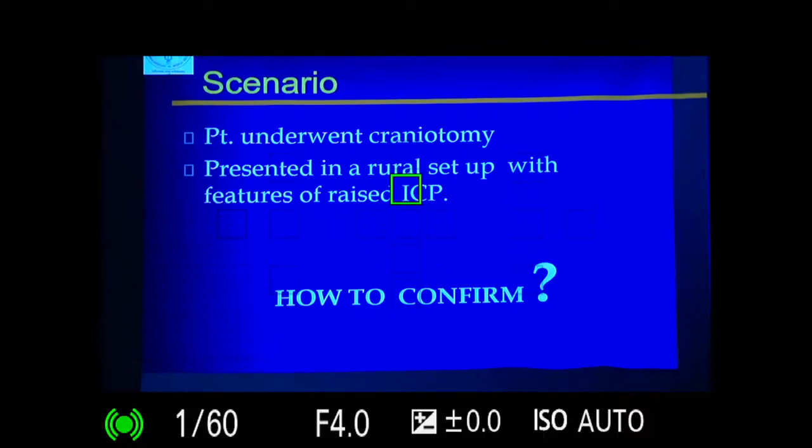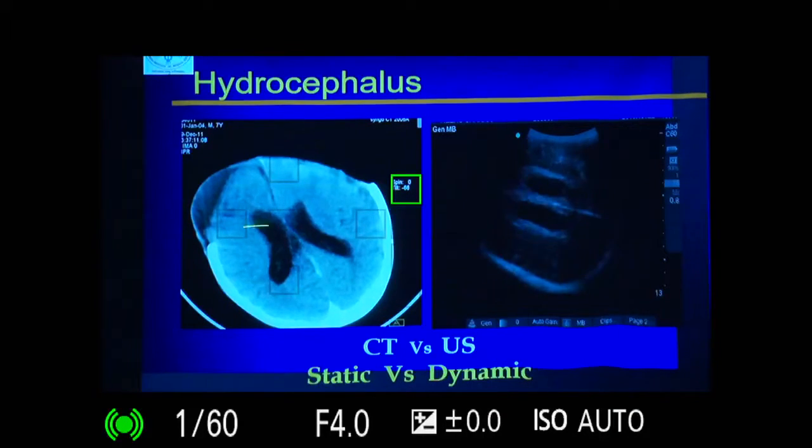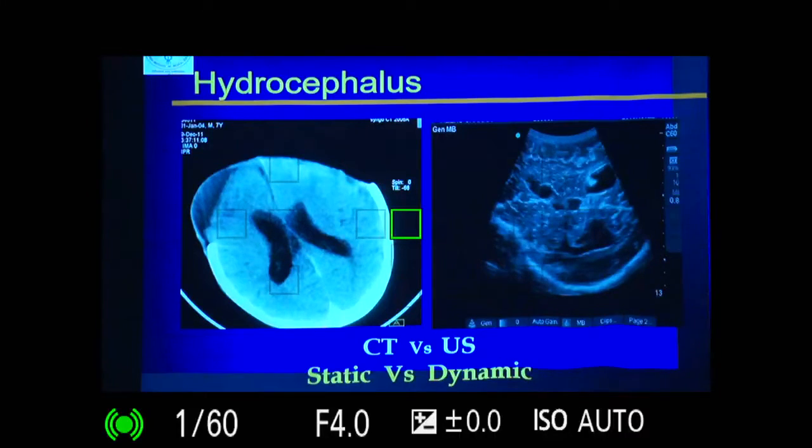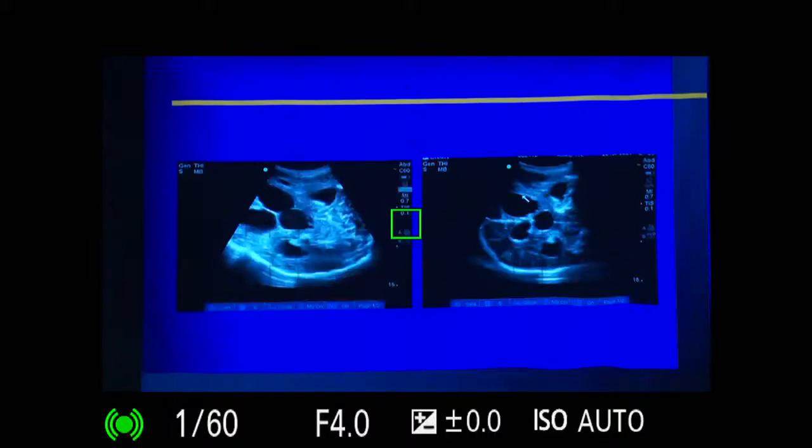So you can actually, like in this example, put your ultrasound probe there. This is a patient who had a bifrontal craniectomy. When you put your probe, see how beautifully you can see the brain. It's like an MRI. You can see there is some ventriculomegaly, there is some collection here. Can you see that? So this collection is also there, and you can rule out the most important complications after decompression. You can get hydrocephalus, you can get some subdural collection or something like that, and an abscess. That's all the three, and you can see all these very nicely.